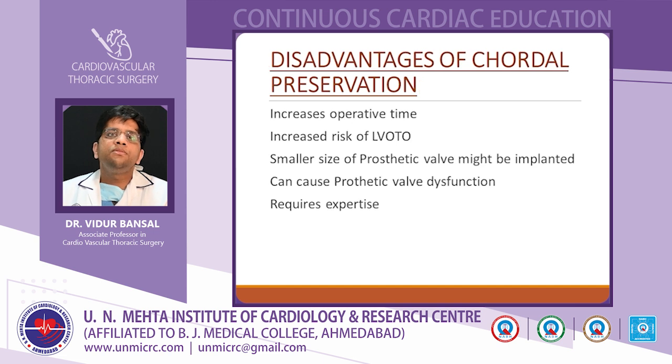The disadvantages include obviously it increases the operative time. There is increased risks of left ventricular outflow tract obstruction in some of the techniques that had been described earlier. A smaller size of prosthetic valve might be implanted because of chordal preservation. It can cause prosthetic valve dysfunction, and it requires expertise.